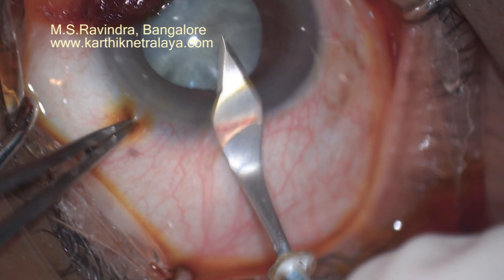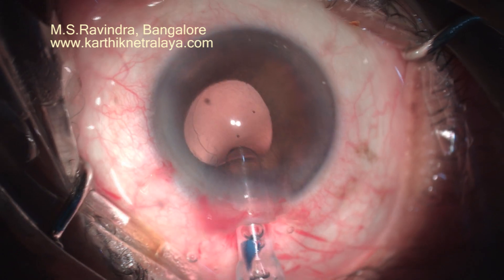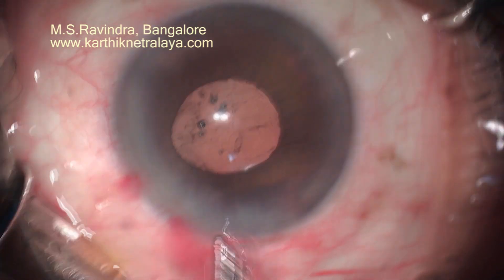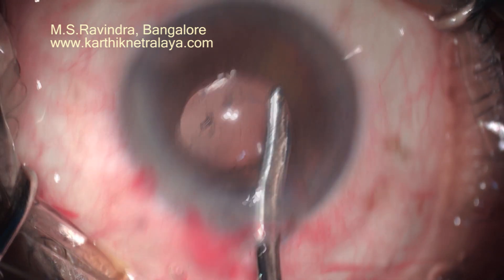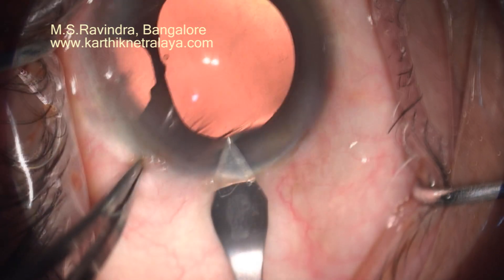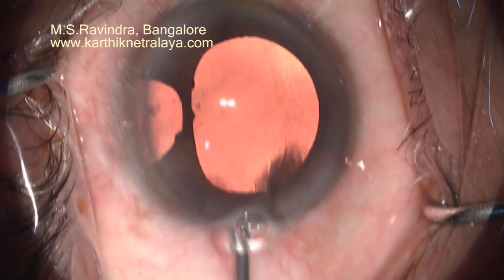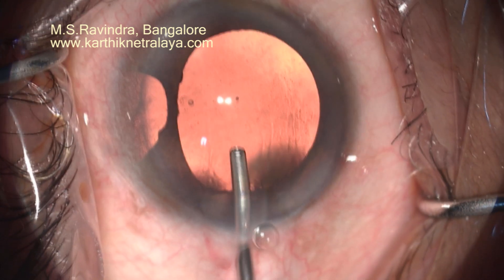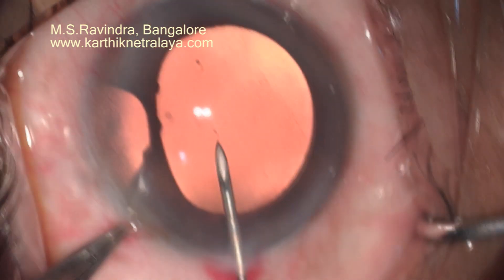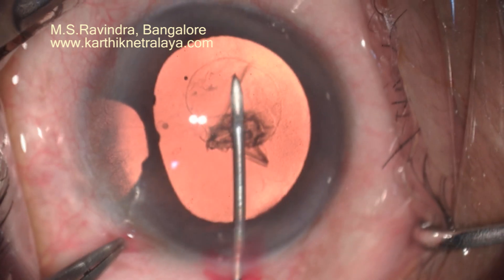It is better to avoid hard cataracts, hard nuclei, and mature cataracts with the direct translimbal approach because there will be increased damage to the cornea. After gaining sufficient experience, you can use this technique for all your surgeries. In this case, a trabeculectomy was done 30 or 40 years ago; the patient has well-controlled pressures and has come for cataract surgery. This technique is ideal for such patients. The entrance is temporal — the steep meridian — while the vertical meridian is quite flat, so the tunnel is made a little shorter to correct a certain amount of astigmatism.